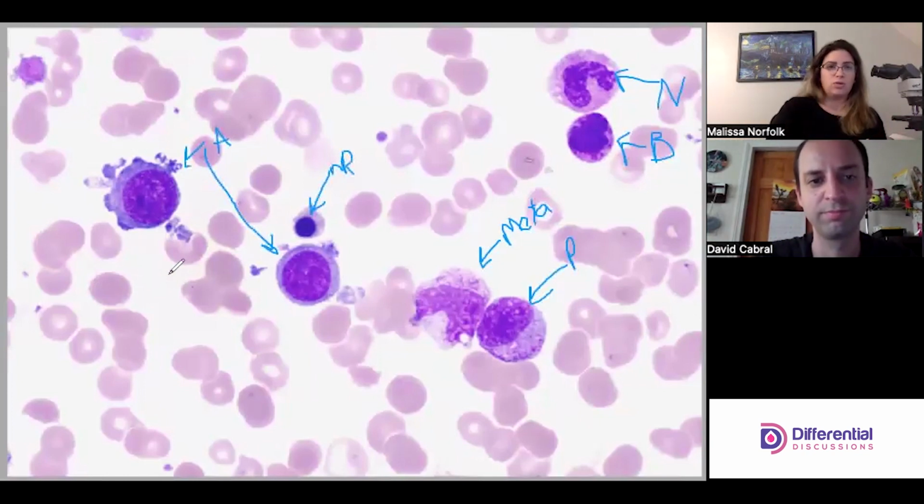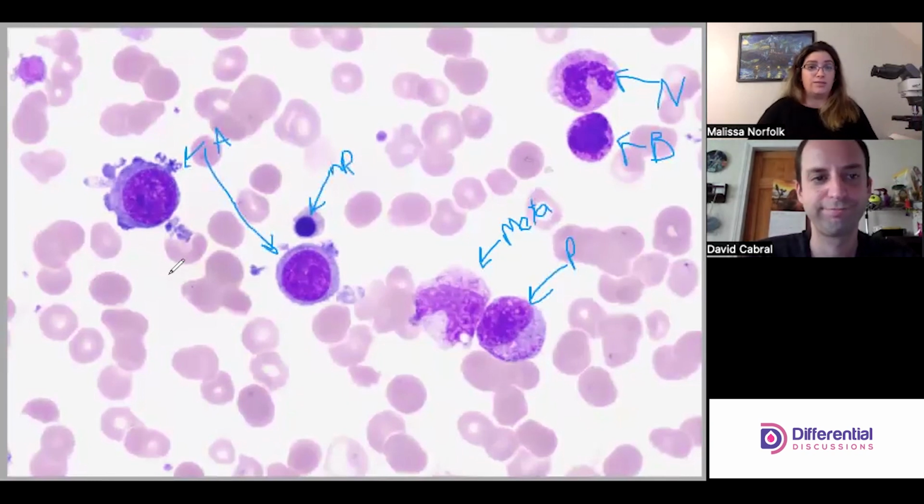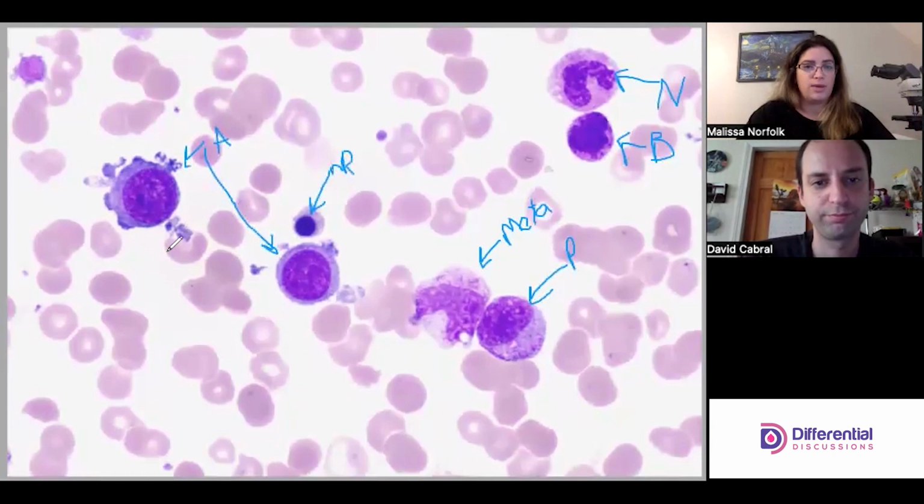We know it's abnormal, and we know it has to be an abnormal megakaryoblast because that's what this patient has. Again, Flo told us that that's what this one was. If you looked at it and thought it could be, in a vacuum, an abnormal plasma cell, sure, okay, in a vacuum I could totally go with that. But in the context of the patient, we know that it's blebby and it looks like megakaryocytic.